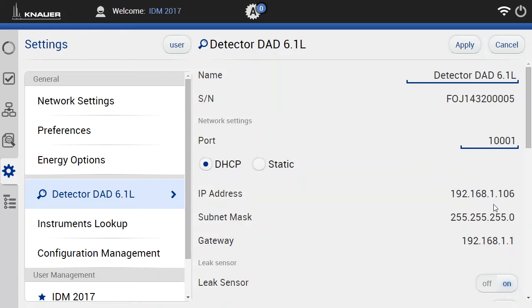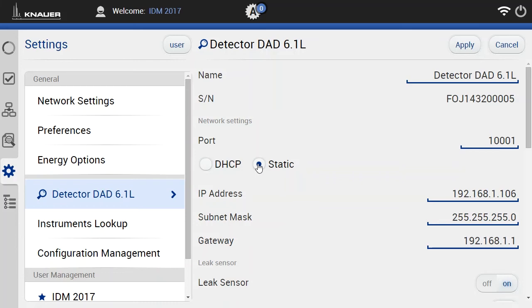But for some cases it might be necessary to have a fixed IP for an instrument, and this can be done very easily with mobile control by just clicking here on the static button. And now you can type any IP number you like.